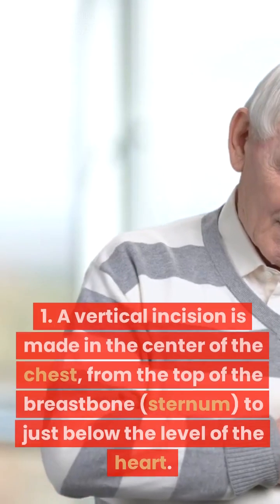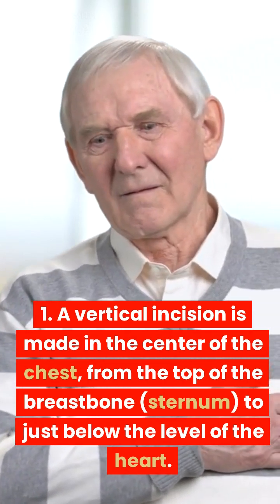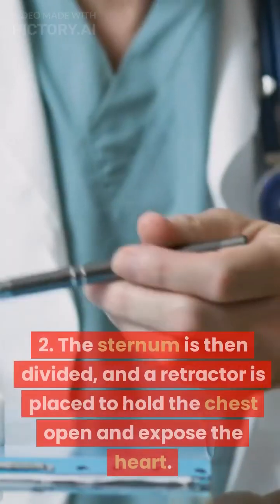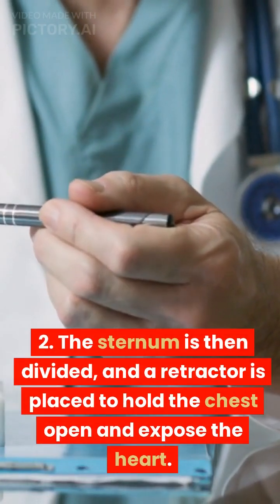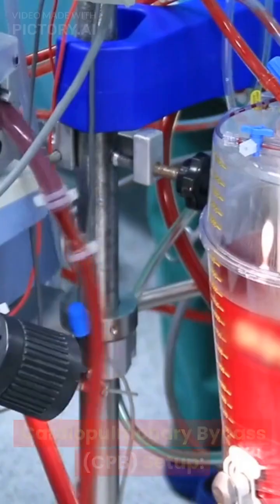Sternotomy. 1. A vertical incision is made in the center of the chest, from the top of the breastbone, sternum, to just below the level of the heart. 2. The sternum is then divided, and a retractor is placed to hold the chest open and expose the heart.